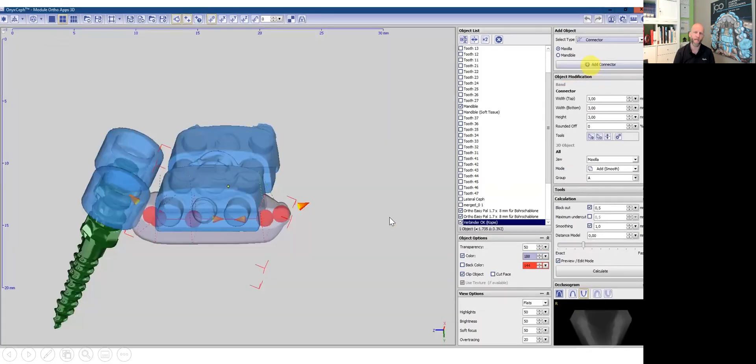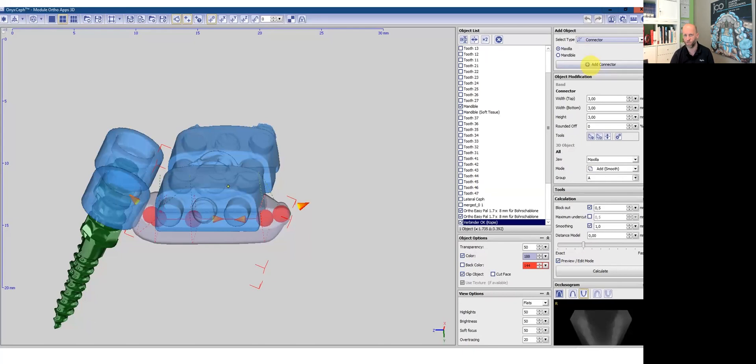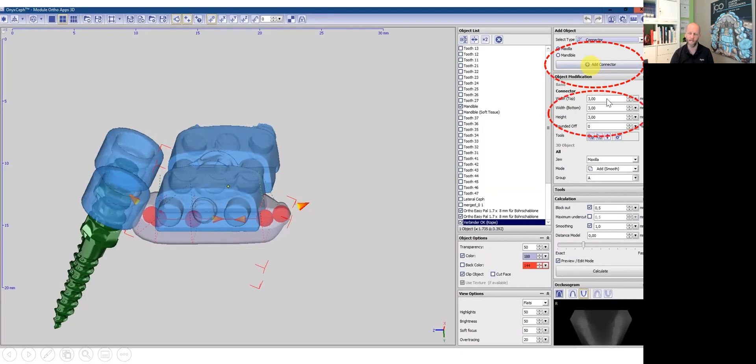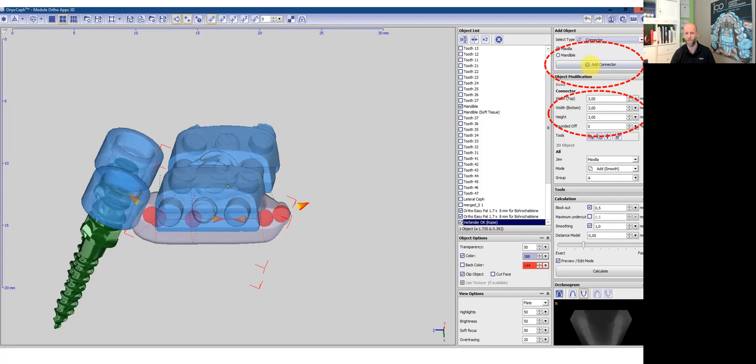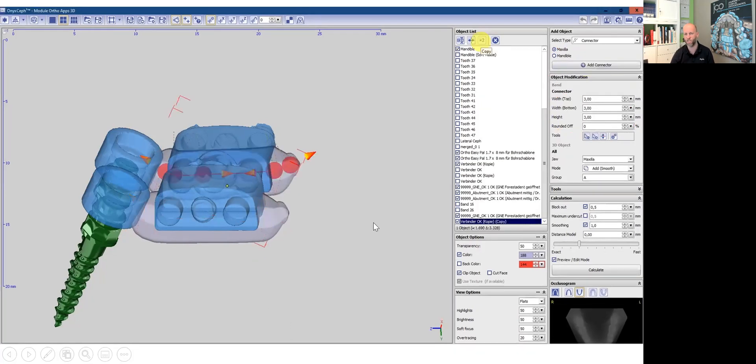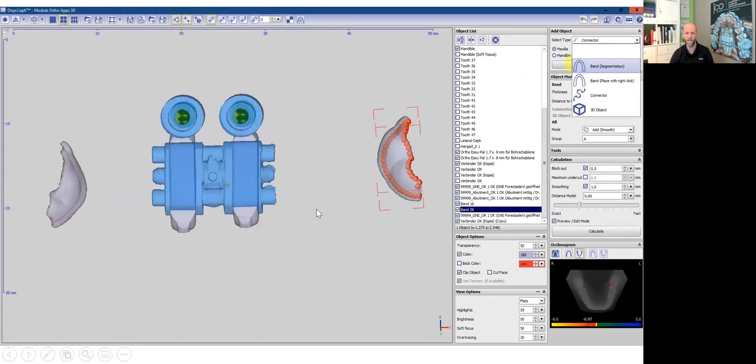Now we have to connect abutments and the expansion screw with so-called connectors. So I click on the field called connector. By selecting the numbers or changing the numbers, I can make the connectors wider, bigger or whatsoever. I personally like quite robust, rigid connectors. So I use these numbers. When I have one connector, I can just multiply it and mirror it to the other side.